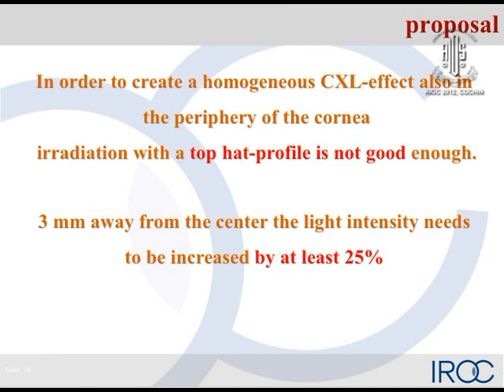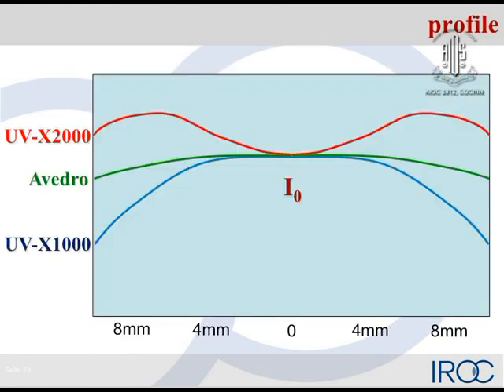And therefore we designed, at IROC, a profile, because a top-hat profile is just not good enough. We need to increase the intensity of the light in the mid-periphery by at least 25%. There's where my financial interest comes in.